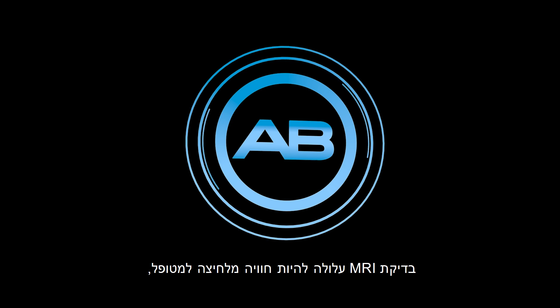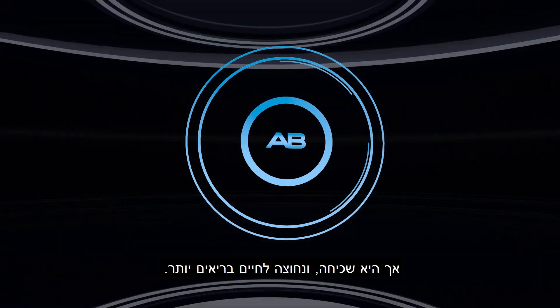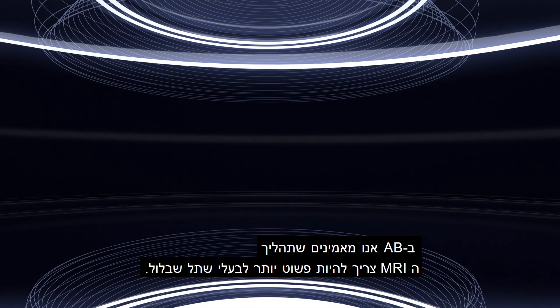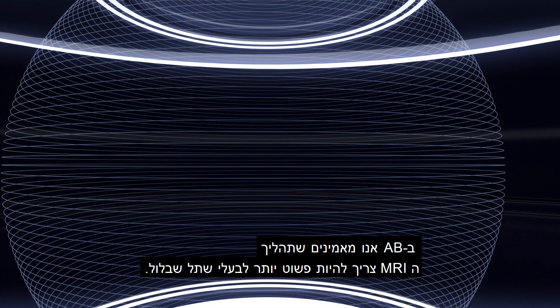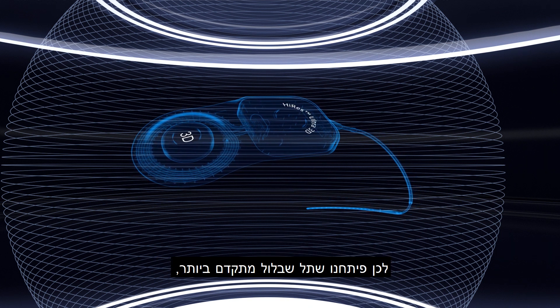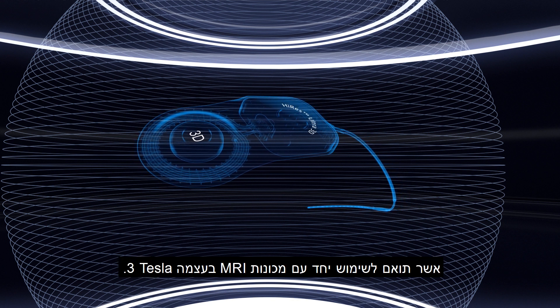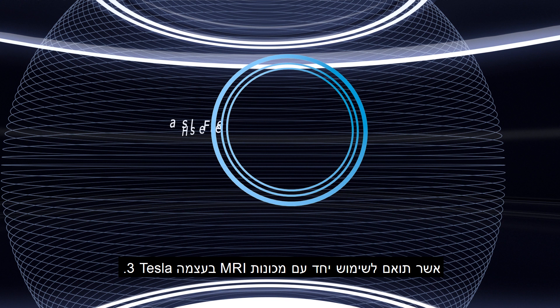MRI examinations can be stressful but are a common and necessary part of life. At AB, we believe that the process of MRI should be hassle-free for all cochlear implant patients. That is why we've developed the Hi-Res Ultra 3D Cochlear Implant, which is compatible with 3 Tesla MRI.